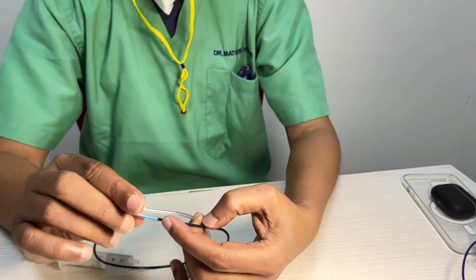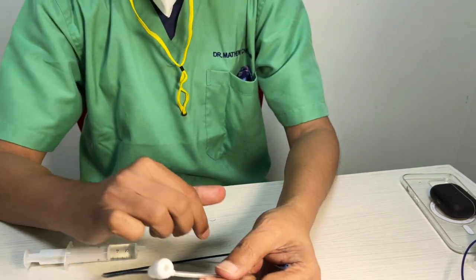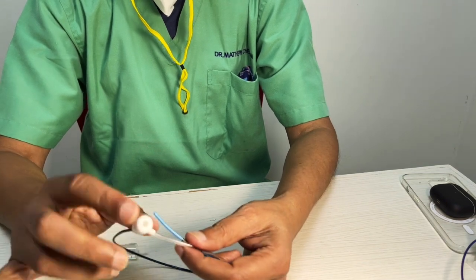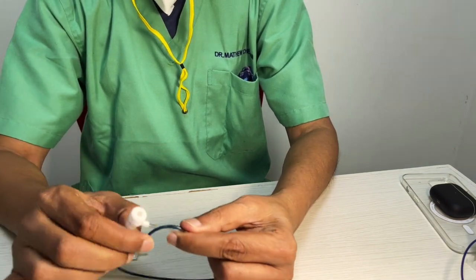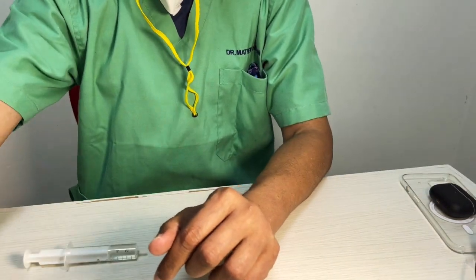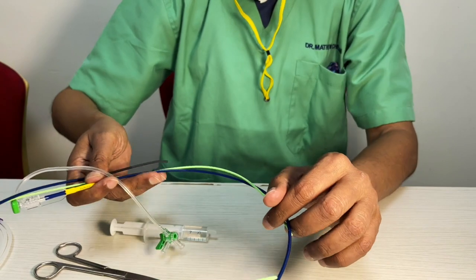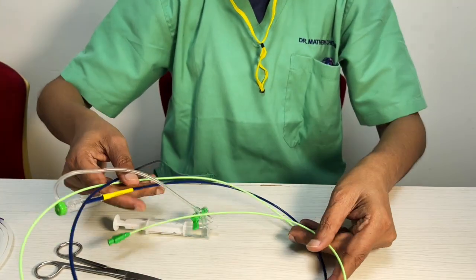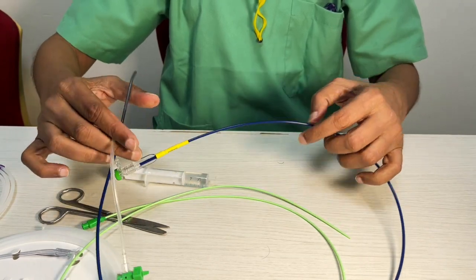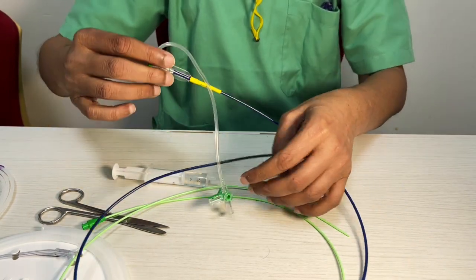So at least in those cases, it's mandatory that you have a dedicated long distal access sheath or a dedicated device like the Neuromax. So again, we have to thank Penumbra for the concepts that they developed, which others technically would improve. So this is the long sheath from Penumbra, which we call the Neuromax.